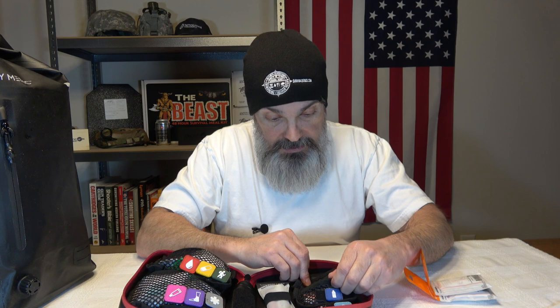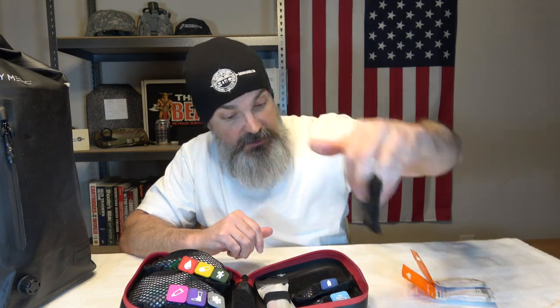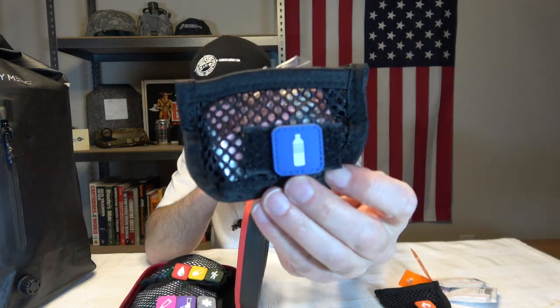We have another little packet here — oh wait, that's even better. All the little packets are Velcro, so you can take them in and out. That's awesome. The next one has a little water bottle icon on it, so let's guess: is that going to be for water purification? It is. We have aqua tabs and a drink mix — two drink mixes.